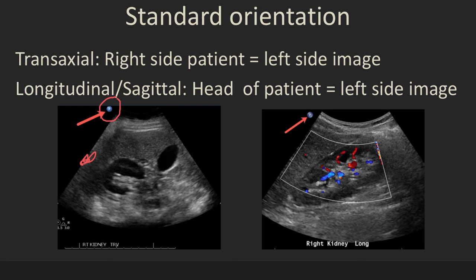For longitudinal sagittal images, the head of the patient is the left side of the image. You can see the liver and kidney longitudinally — the foot of the patient is on the right side of the image and the head is on the left. The transaxial orientation on ultrasound is the same as on a CT scan, which will help if you're used to looking at CT scans.